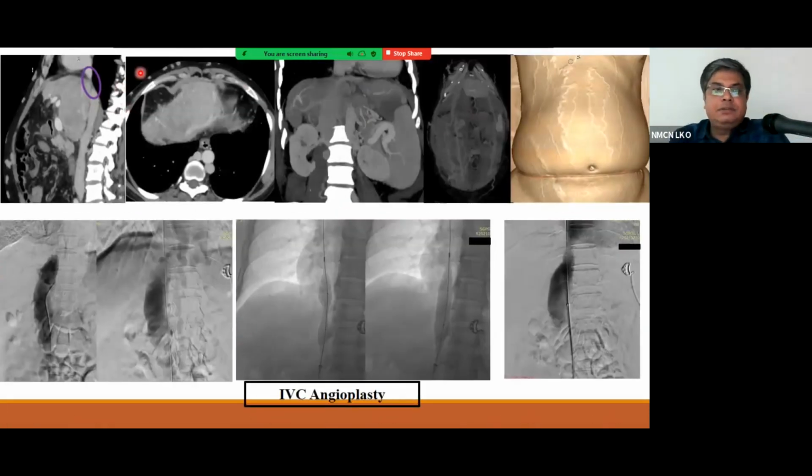So here on this CT image, sagittal reformatted contrast CT image, we can see there is short segment total stenosis, obliteration of upper hepatic IVC with visualization of abdominal wall collaterals and marked hypertrophy of caudate lobe. Here in the axial images, again, we can appreciate these collaterals: abdominal wall, perihepatic, paravertebral, and intramural esophageal varices.